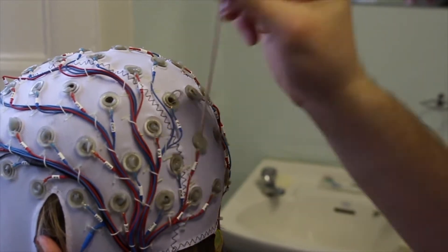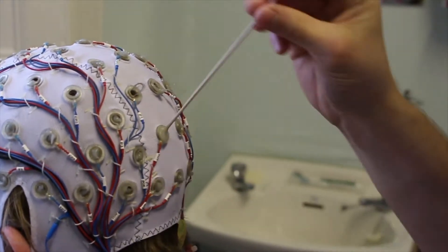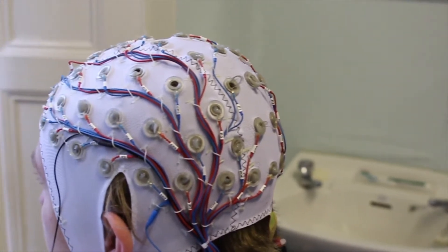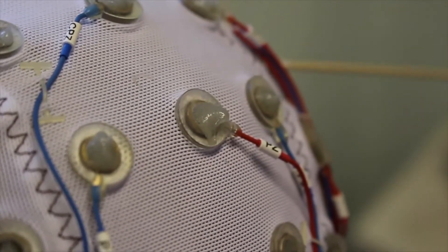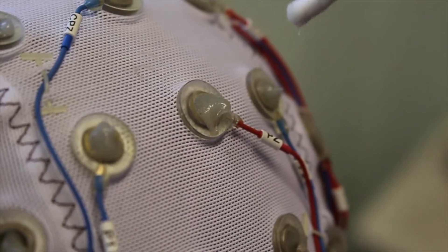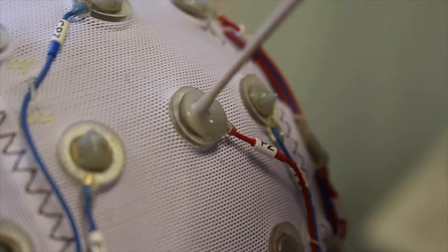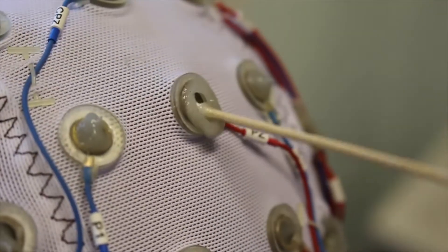Once you have filled all of the electrodes with gel, take a cotton bud and distribute the gel around each electrode as shown. The gel is slightly abrasive and will gently scrub the scalp, cleaning dead skin cells out of the way in order to improve the quality of the signal recorded. You should do this for all 67 electrodes in the cap, not forgetting those on the face and the reference behind the ear.